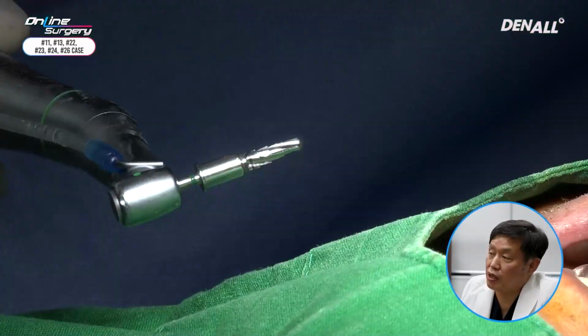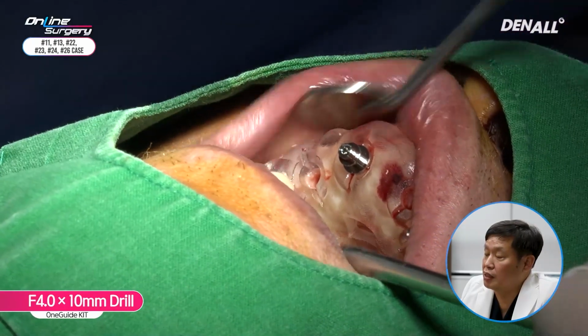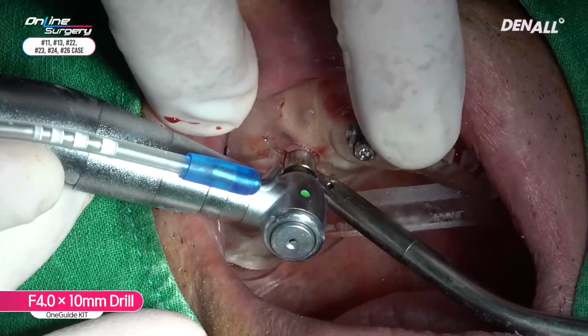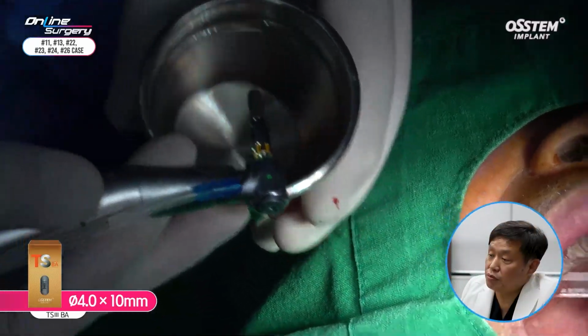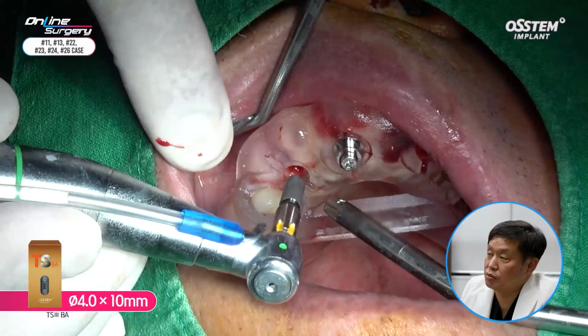Template was nicely fixed. Next is 4.0 by 10 mm OneGuide drill. In number 13, TS3 BA surface 4.0 by 10 mm implant was placed.